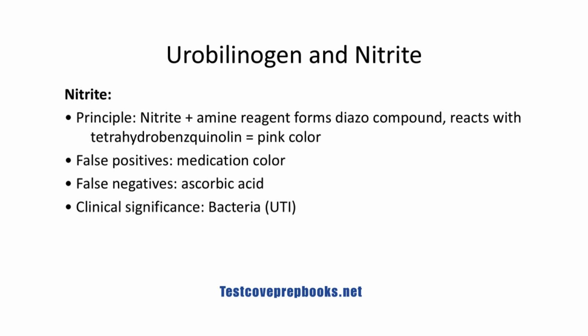Nitrite testing is based on the diazo reaction, where nitrite reacts with amine reagents to form a diazonium compound, which then reacts to produce a pink color. False positives can result from medication color, and false negatives may occur with ascorbic acid. A pink reaction is considered significant for the presence of bacteria, often indicating urinary tract infection.